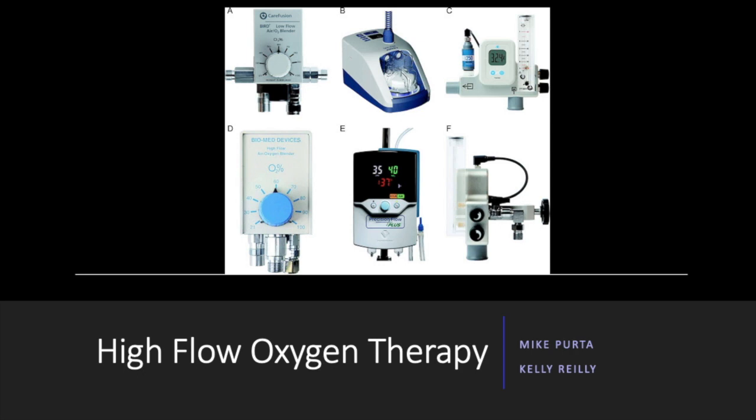Today we're going to discuss the basics of high flow oxygen therapy, go over the indications, how it works, how to set it up, how to titrate it, and essentially how to discontinue it in your patients.